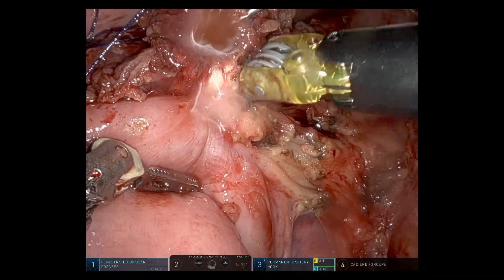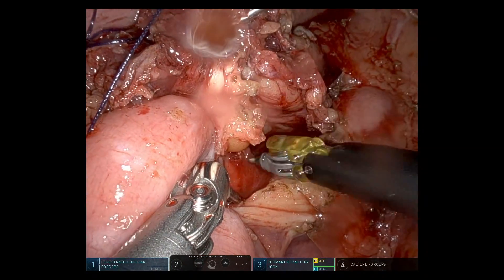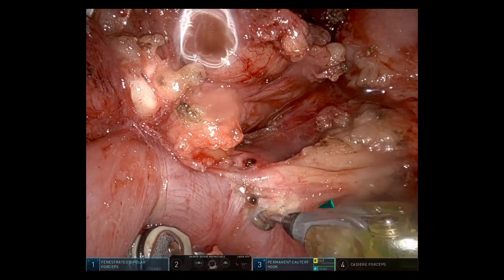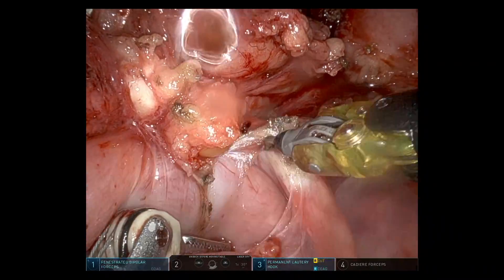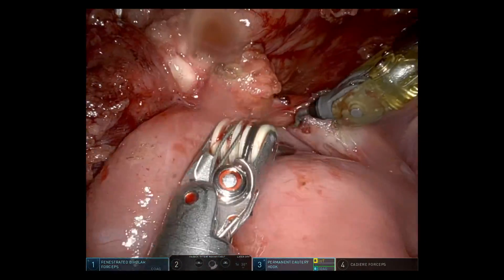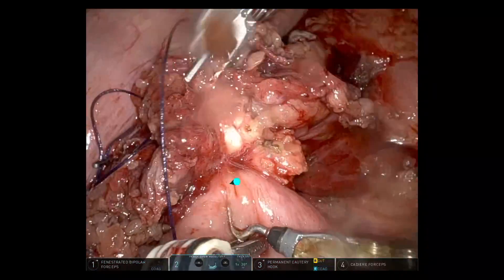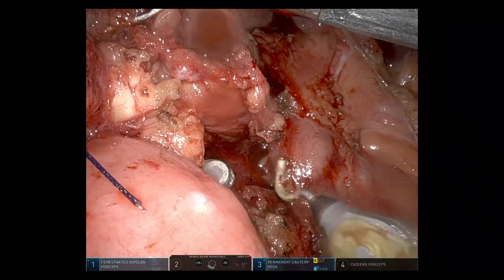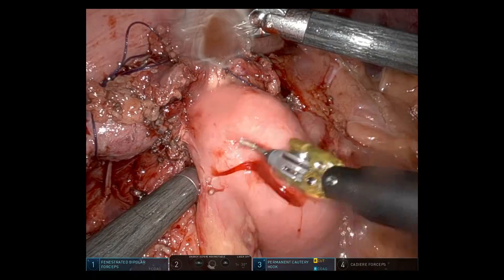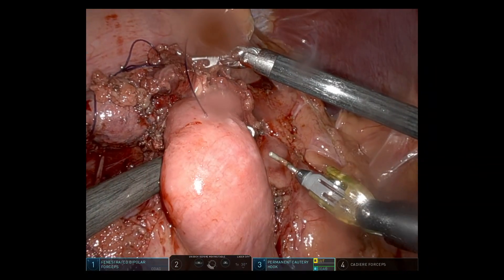Once the vein was dealt with, I moved on to the duodenum and dissected out the ligament of Treitz. The sidewall of D3-4 is drawn into the lesion, so I mobilised this and stapled across the sidewall of the duodenum with the robotic stapler, then overran the staple line with a running V-lock suture. Dissecting through the back of the duodenum to get a tie around before placing the stapler through the tunnel.